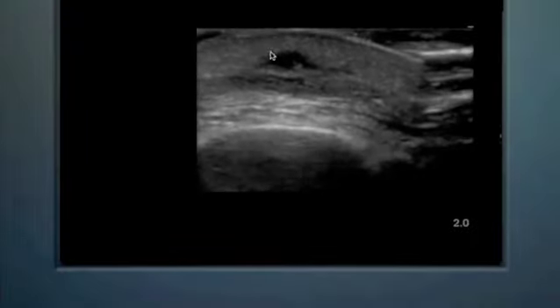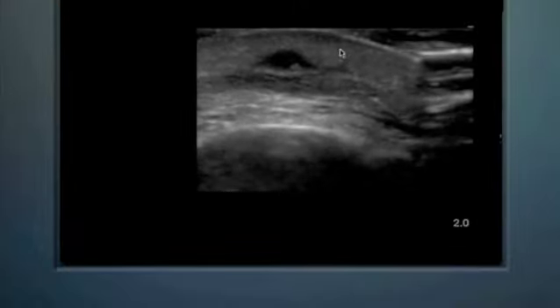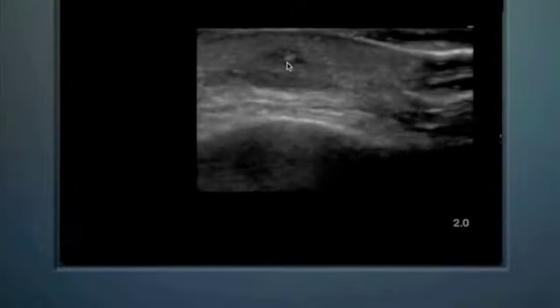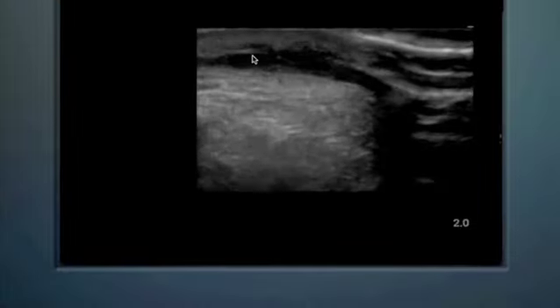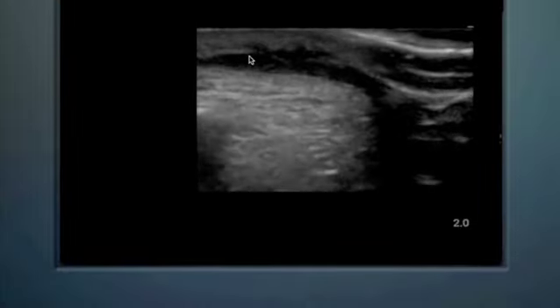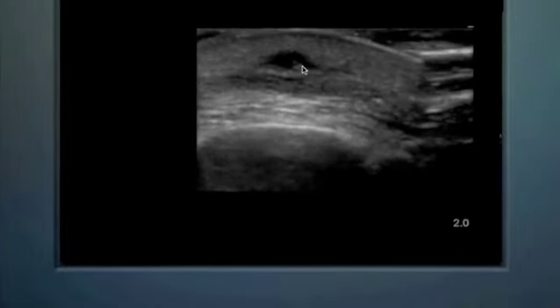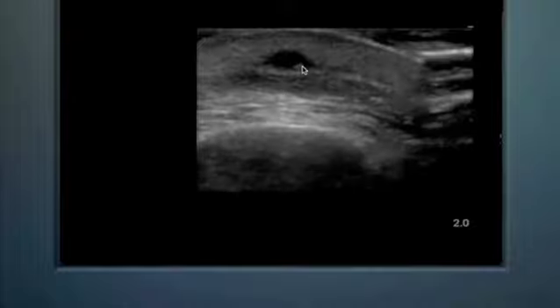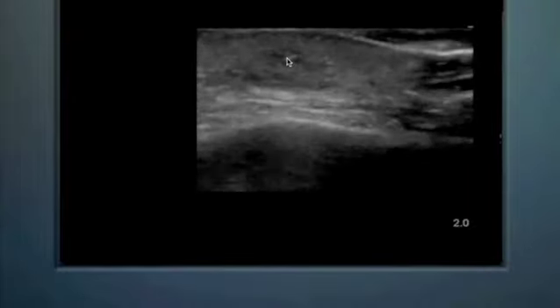This patient has a very, very small abscess. This is actually their eyelid coming along here, and this is a lacrimal gland, which normally is not seen to this degree. And this patient had a very swollen eyelid, and we can make out that small amount of abscess here with a little pus inside of it there. And this required just a quick lancing in order to drain this abscess.